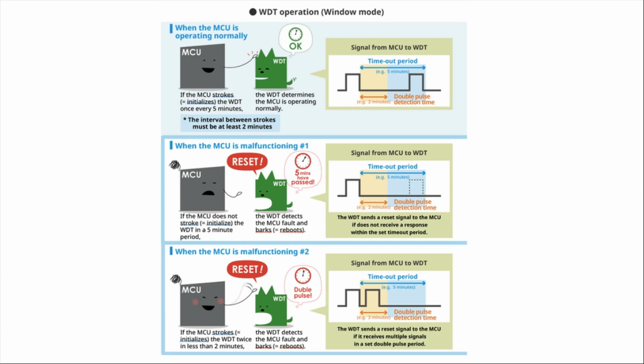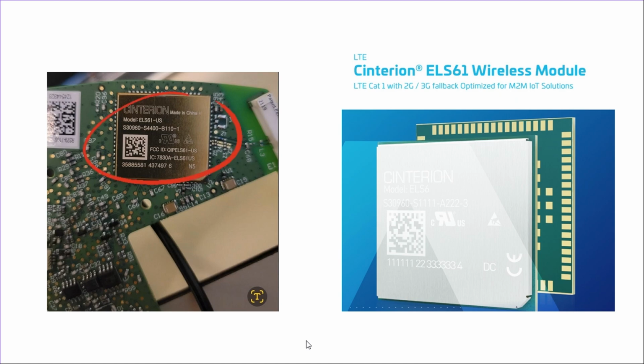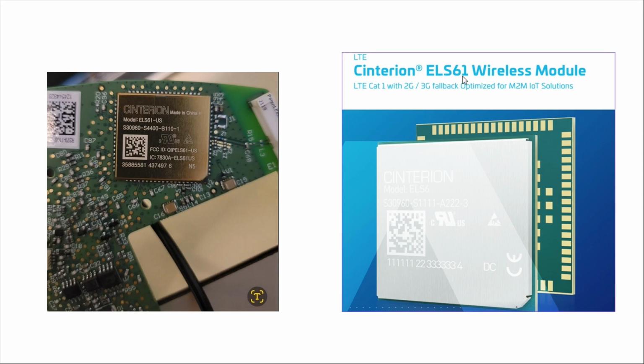If we take a look at the second board on the CPAP machine, we have a wireless modem chip that can handle up to 2G/3G communications. This is used to relay data to whatever service provider your doctor is using to monitor and get your data, along with sending data to the ResMed app, which displays a lot of the data such as AHI, amount of hours slept, and other things as well. So that's going to be another piece of the puzzle for us to solve.